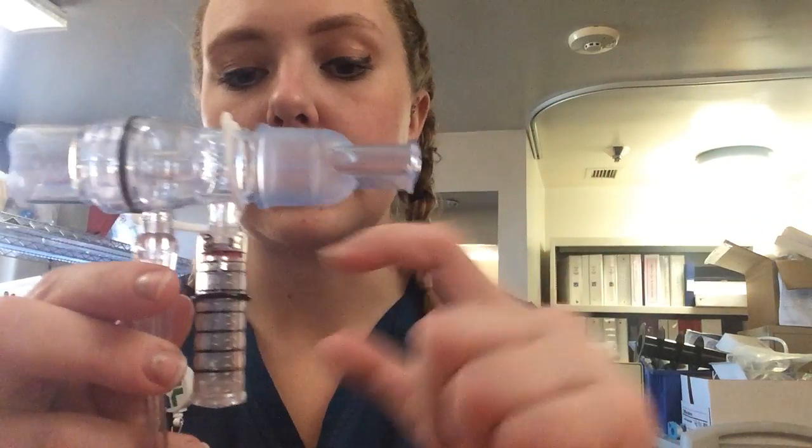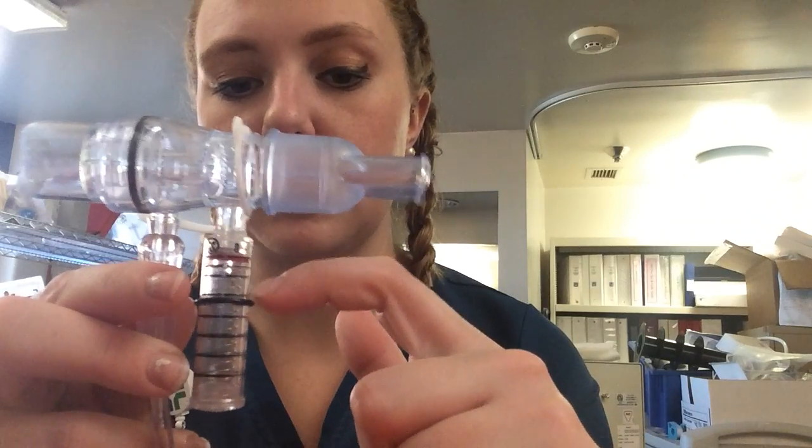I'm going to have my patient inhale and then forcefully exhale — a nice long exhale — getting that red line between the 10 and 20.